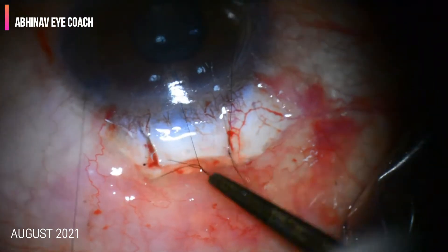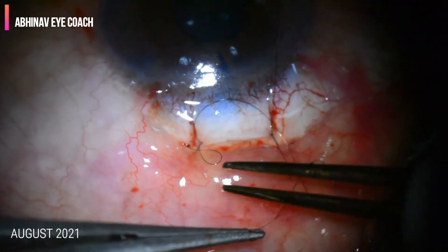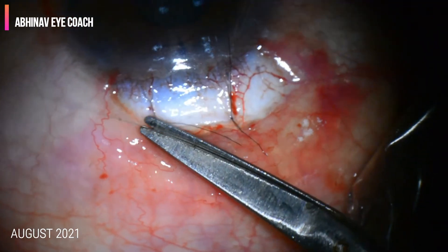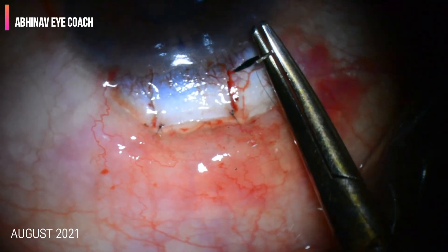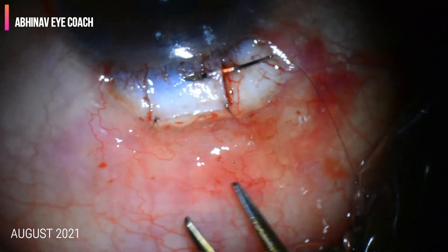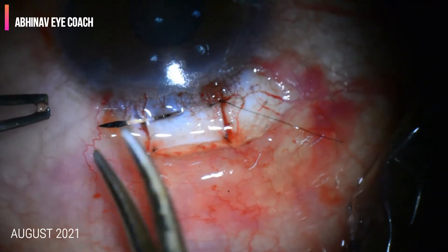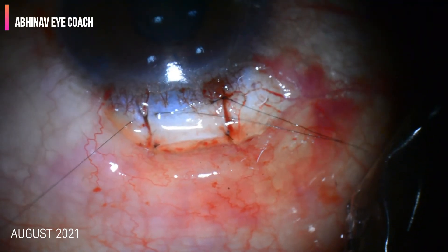Similarly, the other scleral suture is tightened. Two more sutures are applied on both sides of the scleral flap.